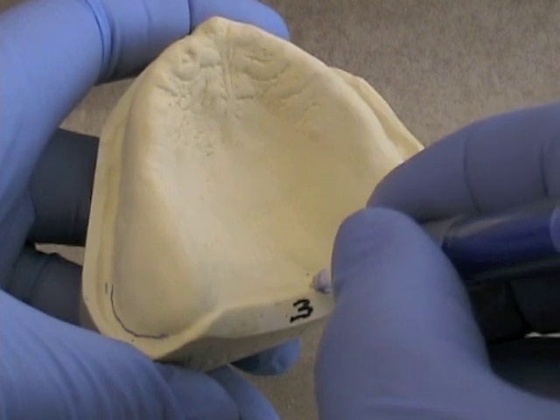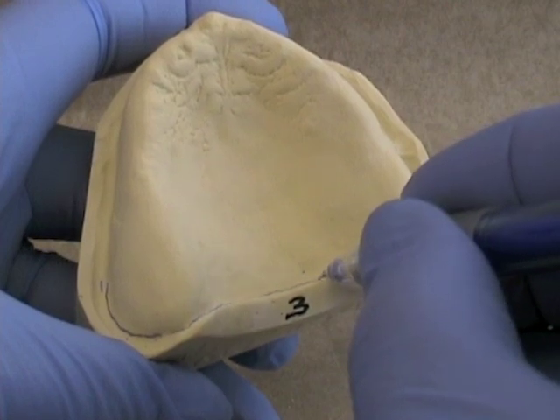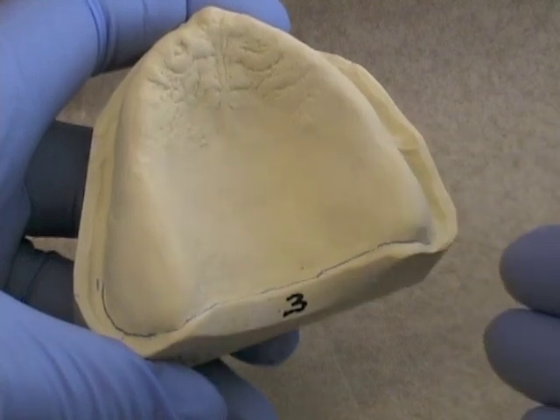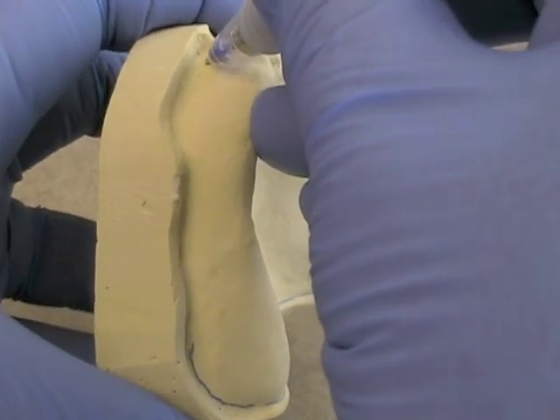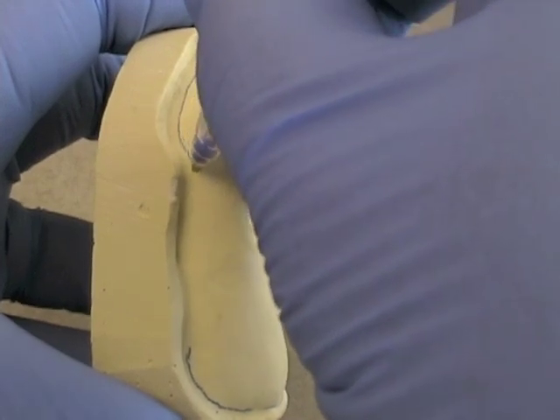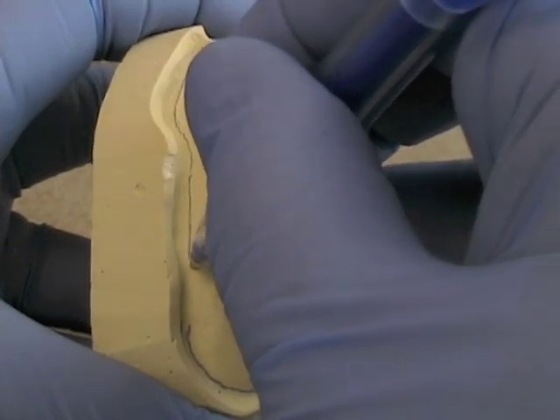We're going to take the tray right to the posterior palatal seal. We don't want to stop short of that area, otherwise it will be difficult to get the compound extended back that far. So in the buccal vestibule, again, 2 to 3 millimeters short, should not be on the horizontal portion of the vestibular height. It should be on the vertical surface.